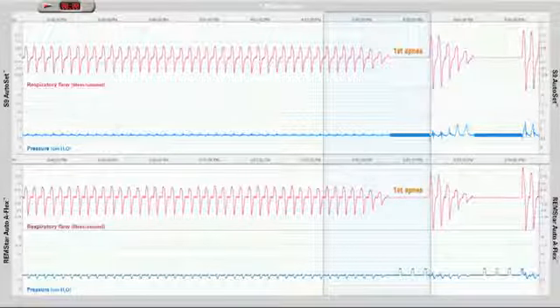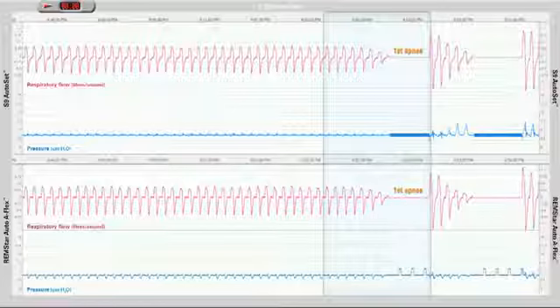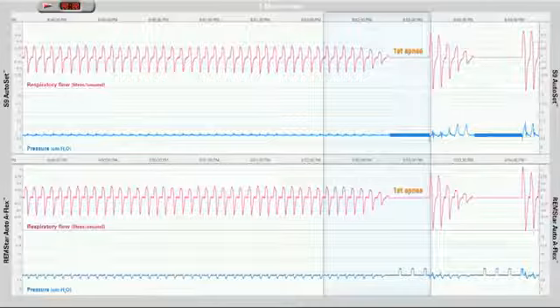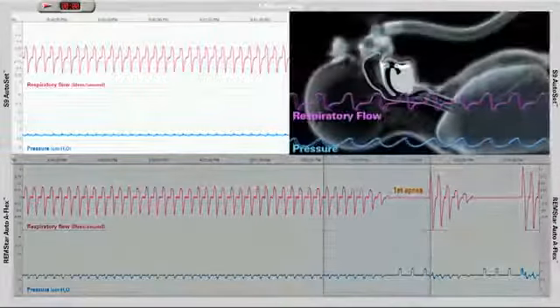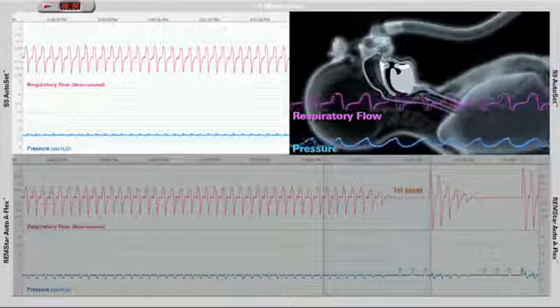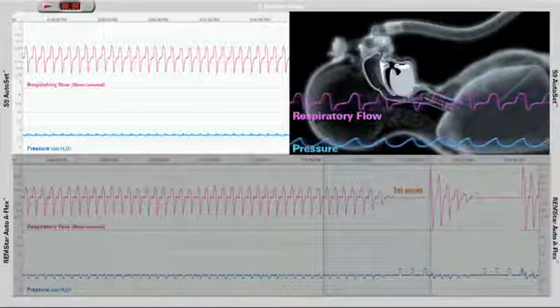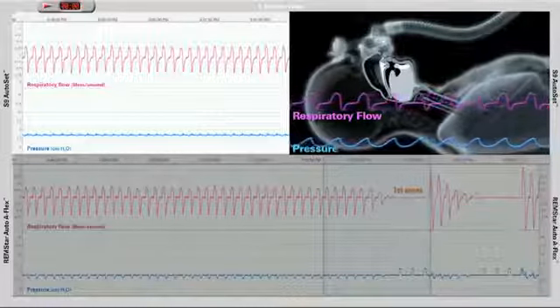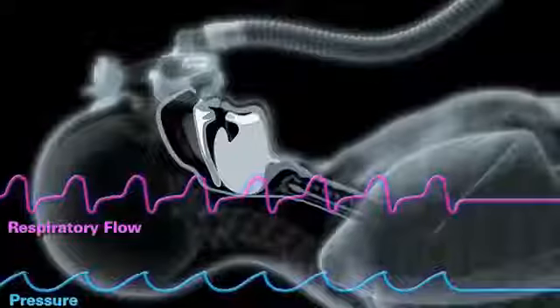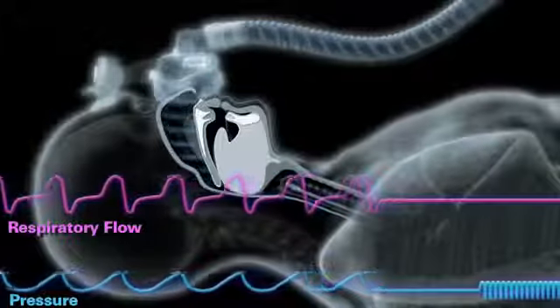During an apnea, the S9 AutoSet and the REMstar Auto device use different techniques to detect if an event is central or obstructive. ResMed's enhanced AutoSet algorithm now incorporates the central sleep apnea, CSA, detector. This uses a forced oscillation technique, FOT, to determine whether the airway is open or closed during an apnea. Small oscillations in pressure are added to the current device pressure.